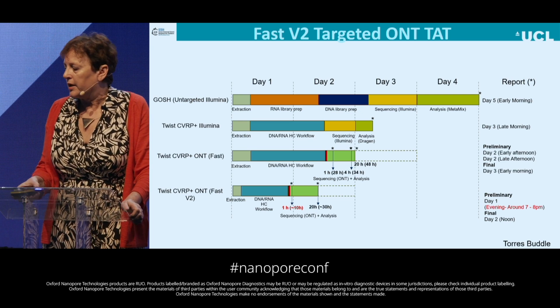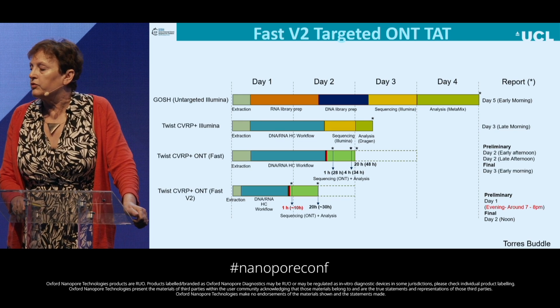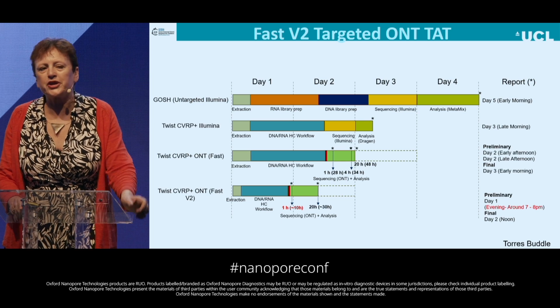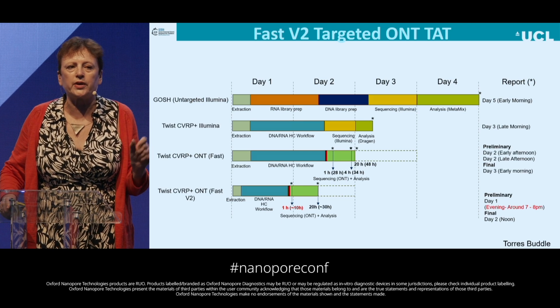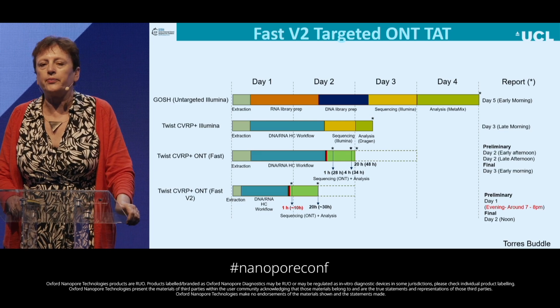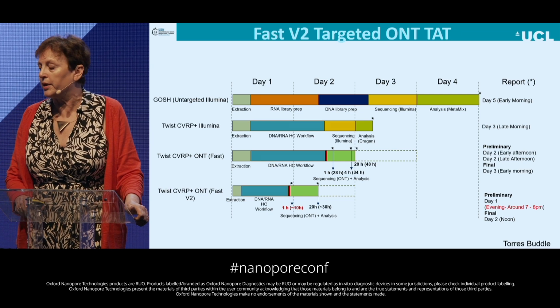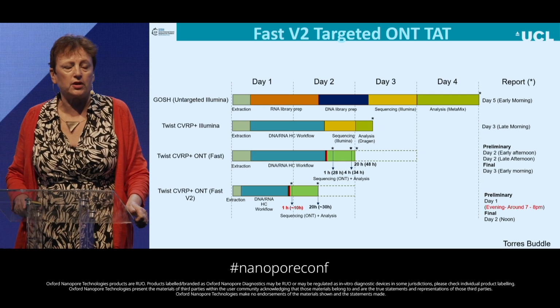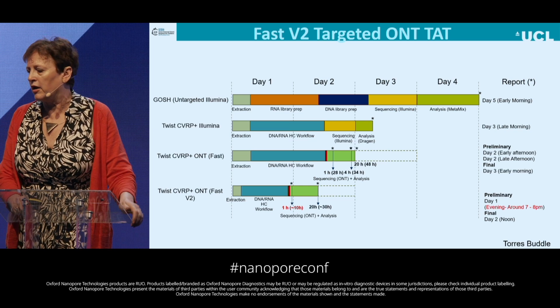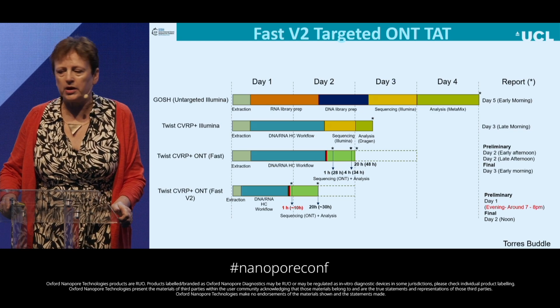And if you look at that, at the bottom, the version 2, if we incorporate these new modifications, then actually we could read out our metagenomics at the same day. It's an extended day, but actually that can come down. If we get the hybridization even lower, which we think we can do, you could probably read out that metagenomics result, which is giving you everything the same day, and that will give you everything at high and medium copy number and quite a lot of what is present at low copy number before, within a day of having received the patient sample. So we're now approaching both the sensitivity of PCR and also the rapidity of PCR. And then, of course, you have to wait till the next day, midday, the second day, to actually read out your very lowest copy numbers.